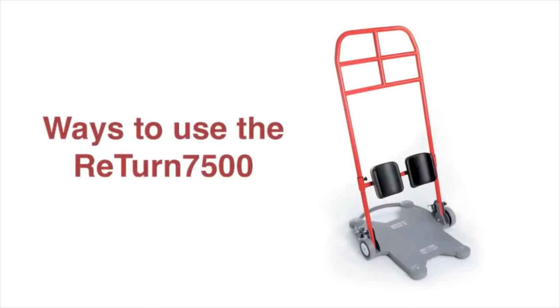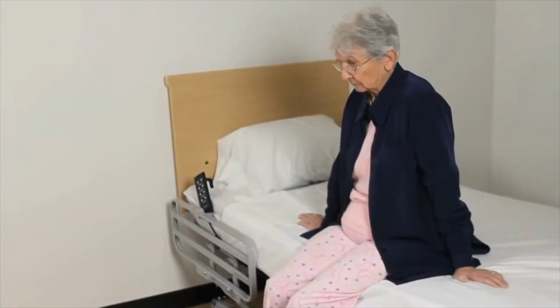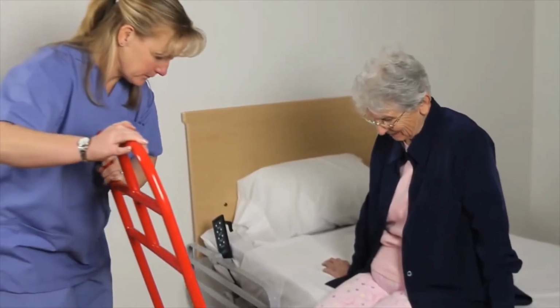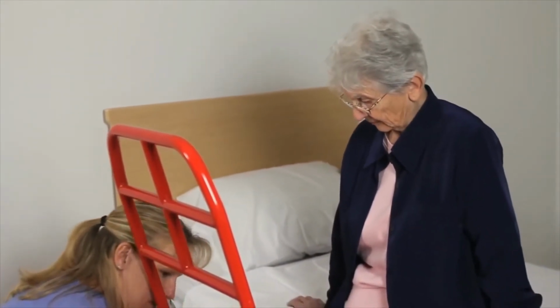Now we will demonstrate the various ways to use the Return 7500. This patient is active and quite strong, but has a problem with balance and walking. The Return will be used to transfer the patient from the side of the bed to a commode. This process may be used when transferring from any seated position to another seated position.